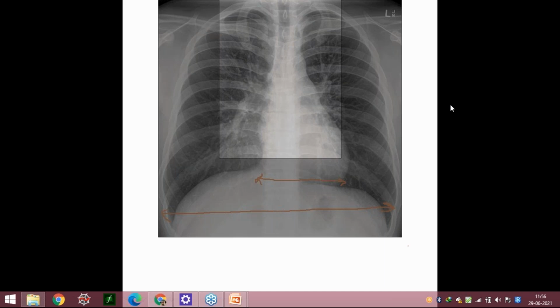Anything else? No, TB is not right. Pulmonary hypertension is not right. Chronic eosinophilic may not be. No, cancer is not right. Pneumonia is not right. Common thing, a cardiac condition, no COPD, no MS. Yes, MS. Spurge, I think, said MS. So yes, in mitral stenosis, there is cephalization of the pulmonary veins. We'll see in the X-ray further.